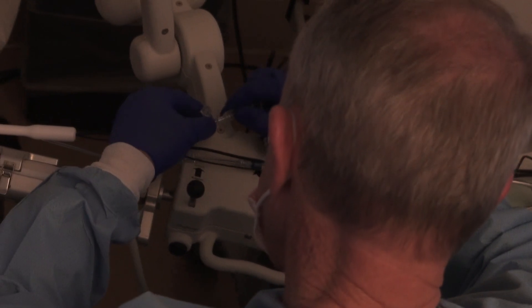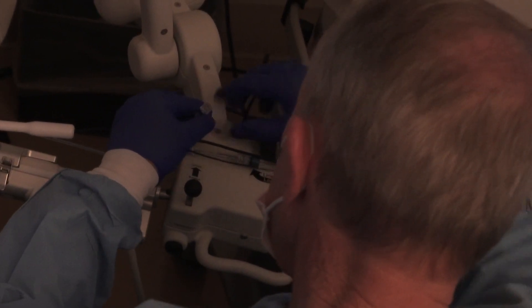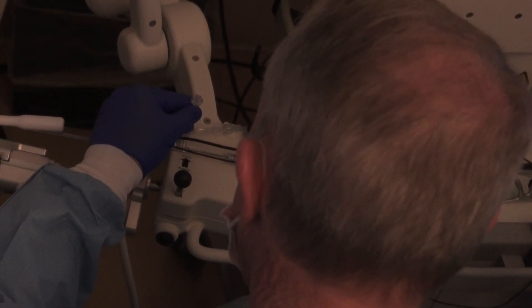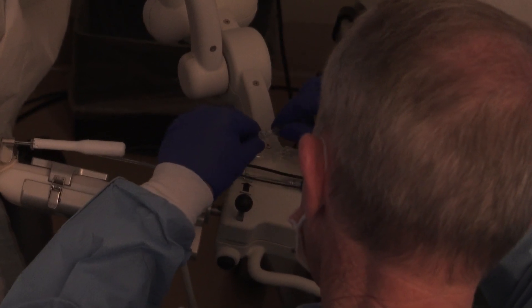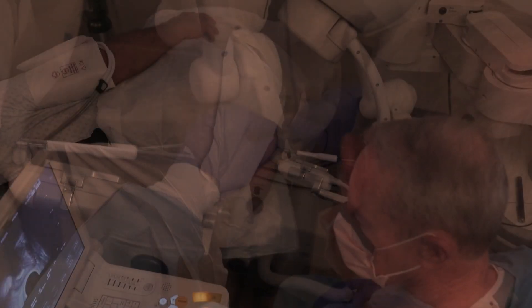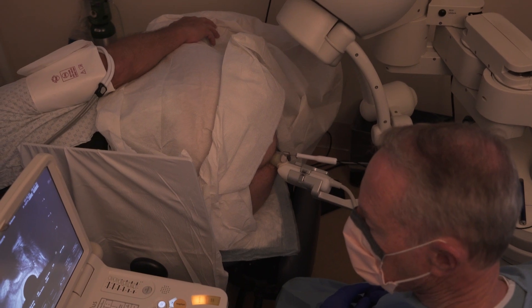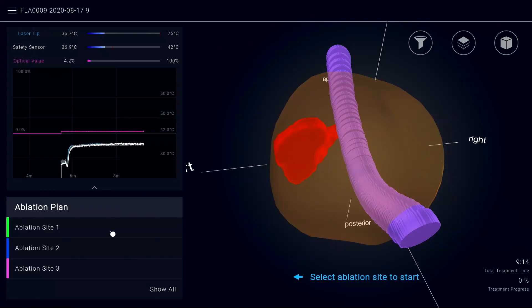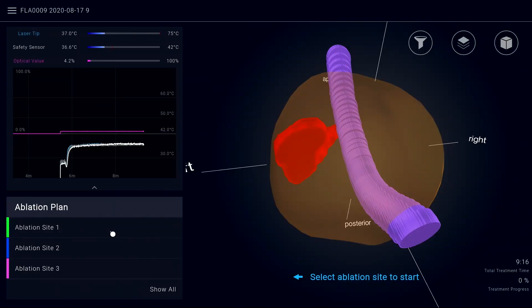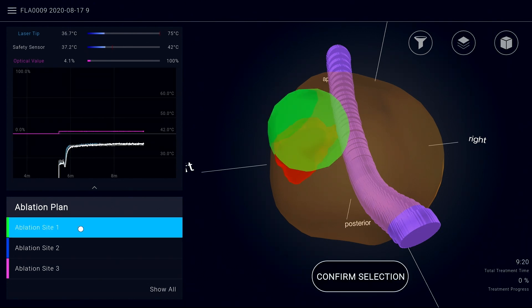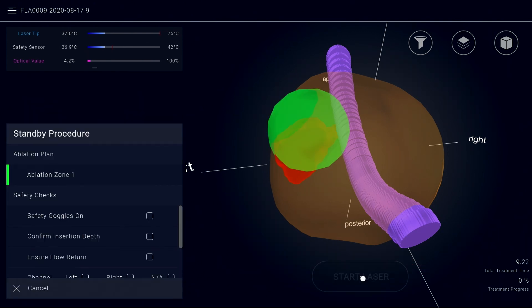Connect the IV tubing from the saline bag to the proximal port on the laser catheter and the return tubing to the distal port on the laser catheter. The operator is now ready to begin the first ablation. On the Orion workstation, select the ablation site that corresponds to the laser catheter position. Confirm the ablation plan selection to begin circulating saline around the laser catheter.